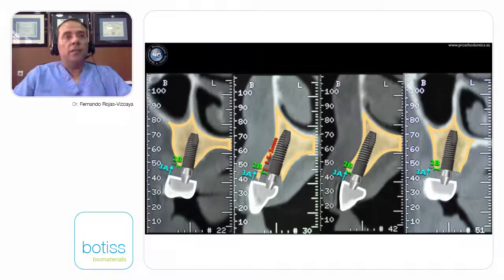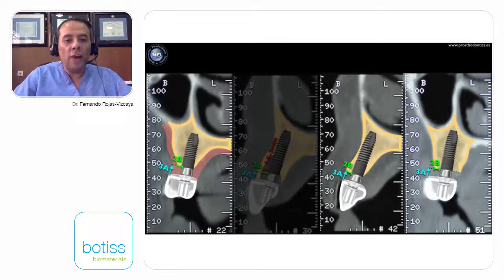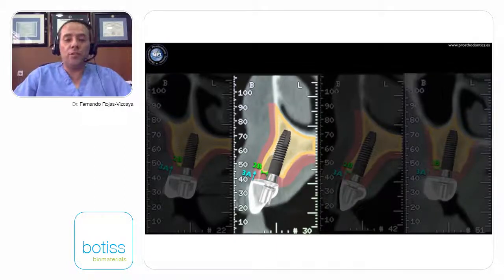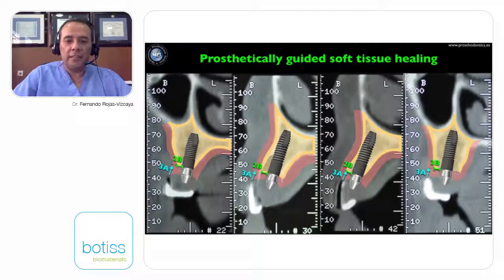If you make the bone reduction, you place your abutment to make the immediate loading. So you put your cylinders, make your pickup, and finish your prosthesis so you obtain this situation. Take a look how the tissue heals below this crown. It heals with the shape of your prosthesis, right? And in the area of the extraction socket, also, after bone remodelation, the soft tissue takes the shape of the prosthesis. So this is how the tissue heals below a prosthesis.